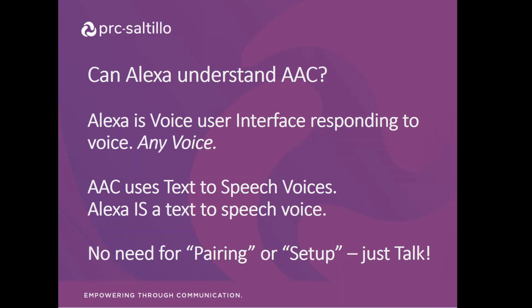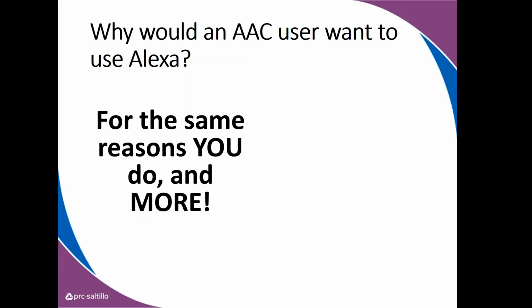All right. So why wouldn't an Alexa AAC user want to use Alexa? And it's really for the same reasons that you do. If you feel comfortable, and this is a good, easy way to throw some things in the chat, how are you using Alexa? If you have Alexa at home, and I like Alexas because they're really inexpensive to have at home, and we'll talk about the different devices, but does anybody feel not afraid to share? How are you using Alexa at home?